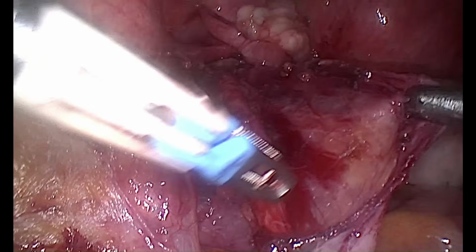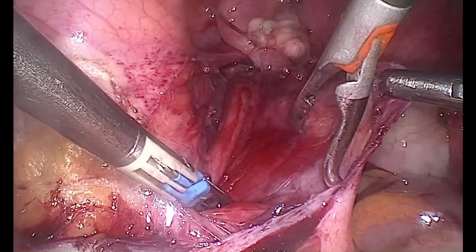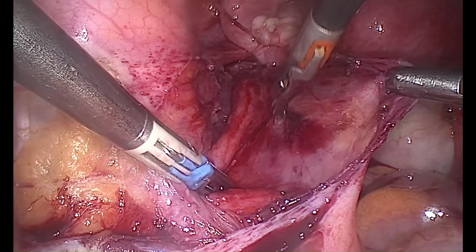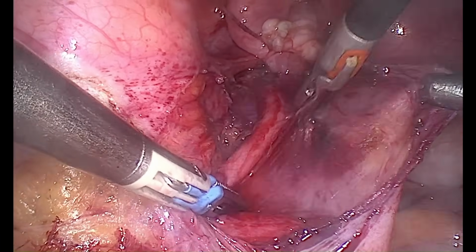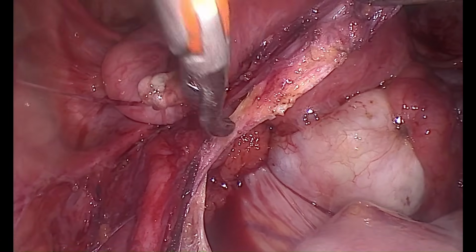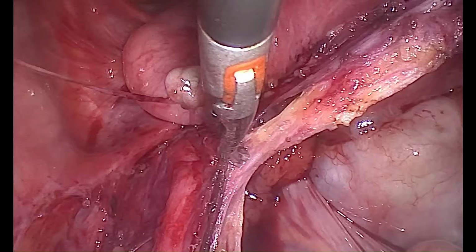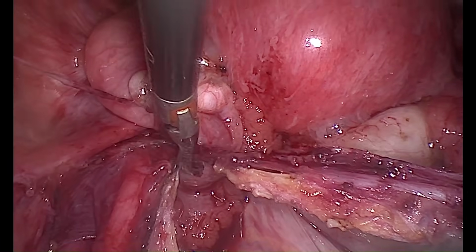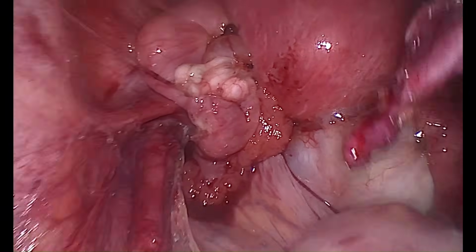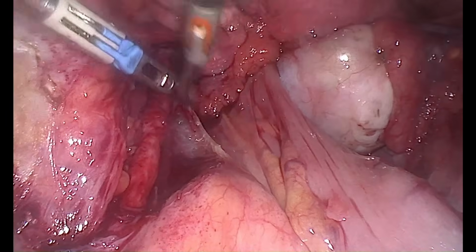This is the procedure wherein we are showing how ureterolysis can be done, and this is the peritoneum which is puckered. We are going to do a peritonectomy in this patient. These are educational videos, so we are coming up with a different series to tell you how things can be done in a particular case. The course of the ureter has to be marked out, and then you can do a peritonectomy. Similar procedures can be done on the opposite side.